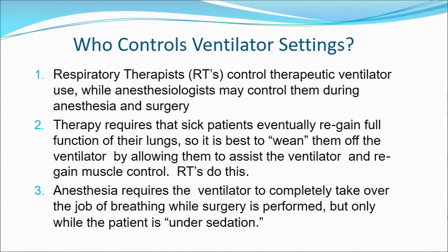Who controls ventilator settings? First of all, it's not you as a biomedical technician, no matter who asks you to do it. Respiratory therapists control therapeutic ventilator use, while anesthesiologists may control them during anesthesia and surgery. Respiratory therapy requires that sick patients eventually regain full function of their lungs. So it is best to wean them off a ventilator by allowing them to assist the ventilator and regain muscle control.